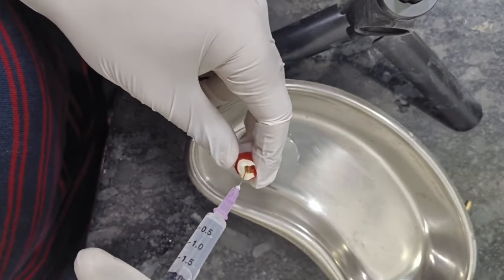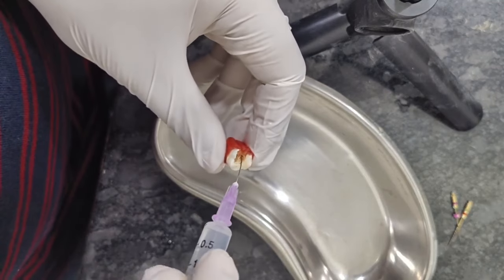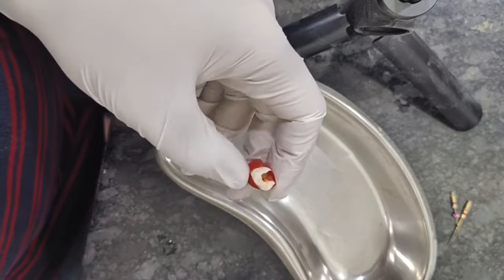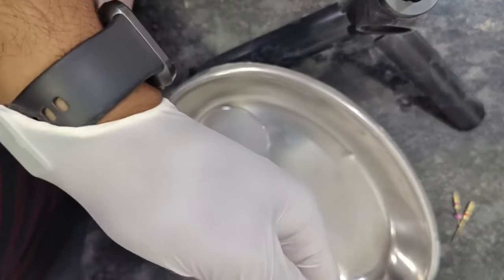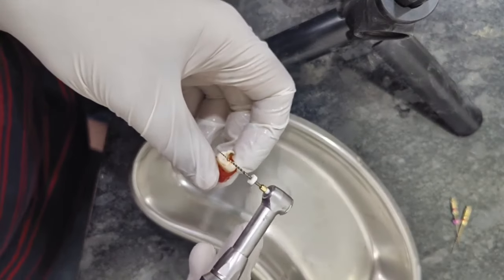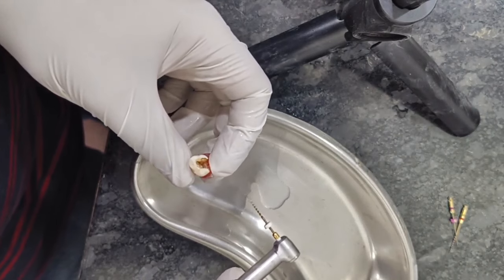So again I am putting the saline solution in all the three canals. Next we jump over to the next file system. So now I am moving to the next file system, which is the 4% 17 number file.